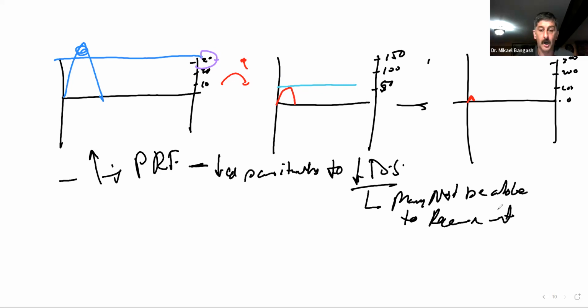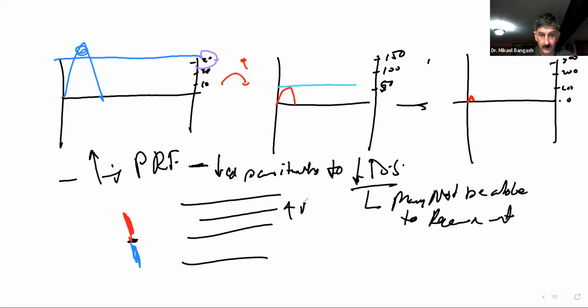And that is going to be obvious when we look at an image where we have a color Doppler, where we might have had two blood vessels, because there was one with the high velocity and a neighboring one with a low velocity.